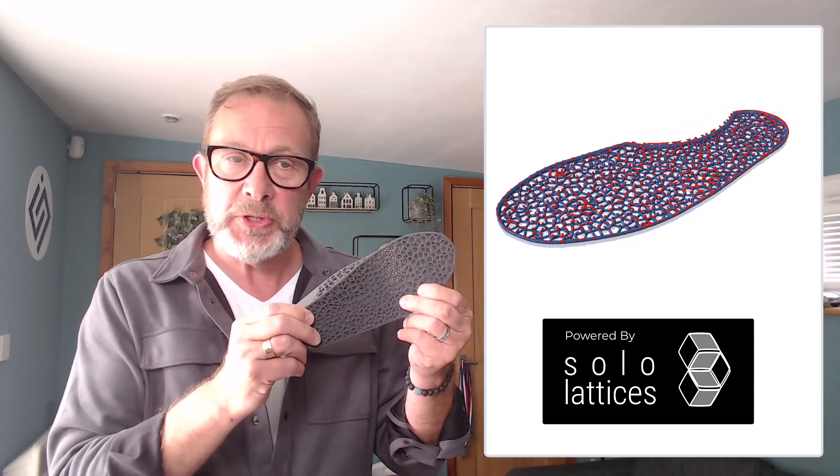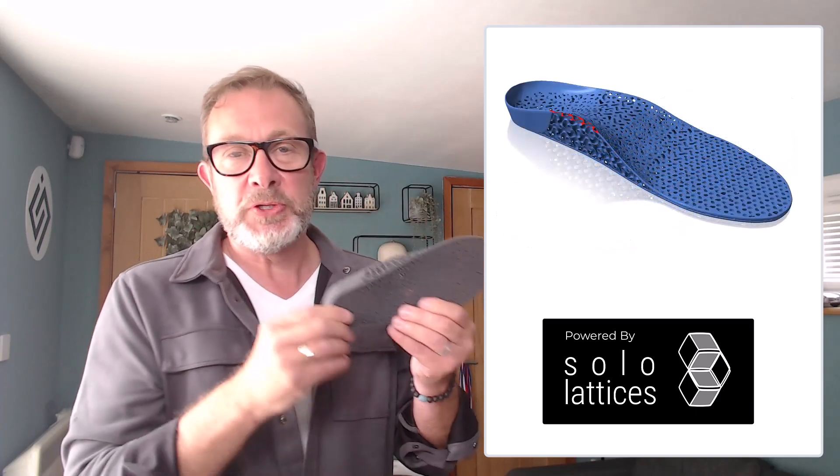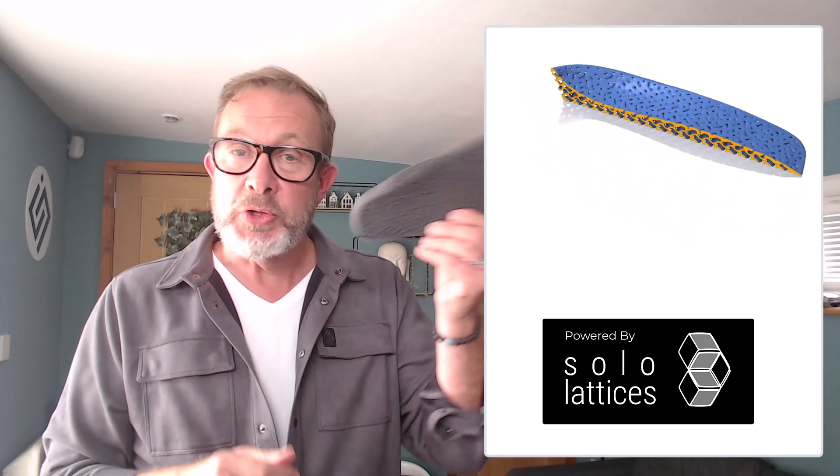One of the major changes in version 4 is the addition of lattice structures for variational geometry. This will enable people to create transitional stiffness through the part to create clinical devices that perhaps in the past were not possible. This is an emerging area, so by adding it to our software we're creating an environment for people to explore and try out these ideas.